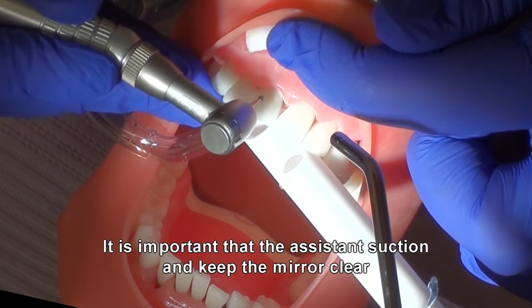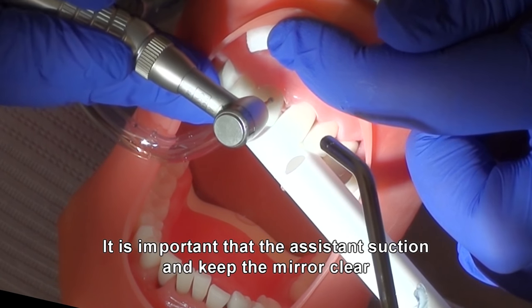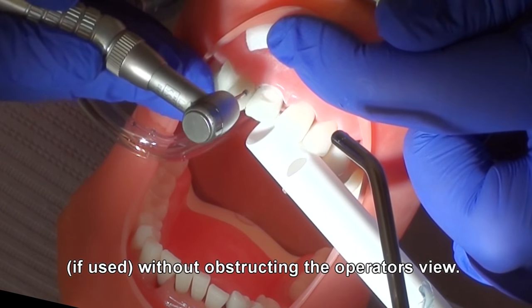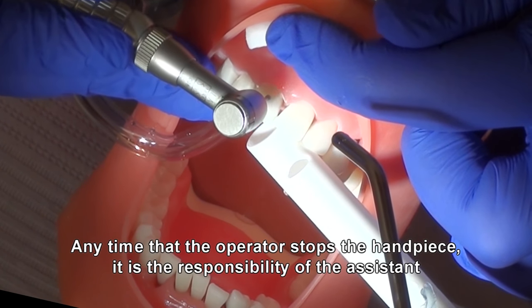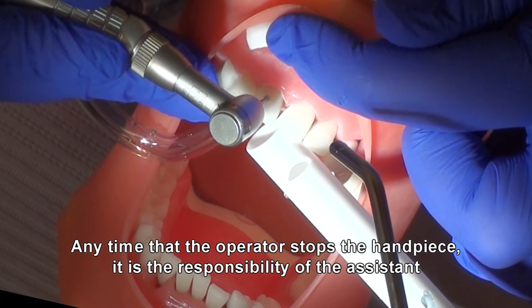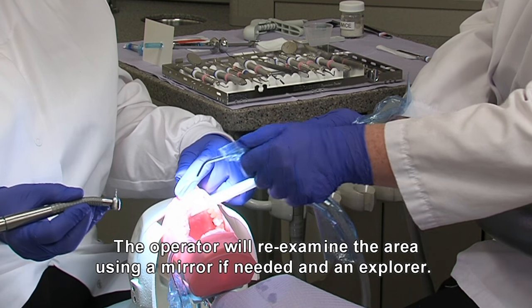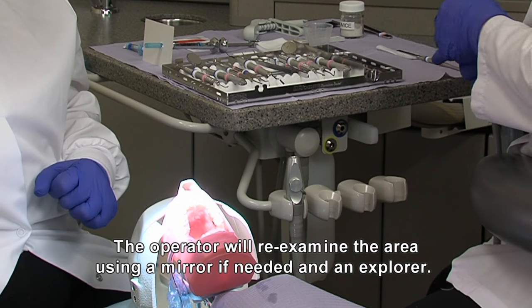The assistant will hold the air-water syringe in the left hand and the high-volume suction in the right hand. It is important that the assistant suction and keep the mirror clear, if used, without obstructing the operator's view. Any time that the operator stops the handpiece, it is the responsibility of the assistant to thoroughly wash and dry the cavity preparation. The operator will re-examine the area using a mirror if needed and an explorer.